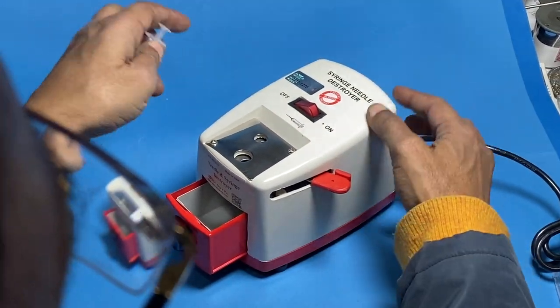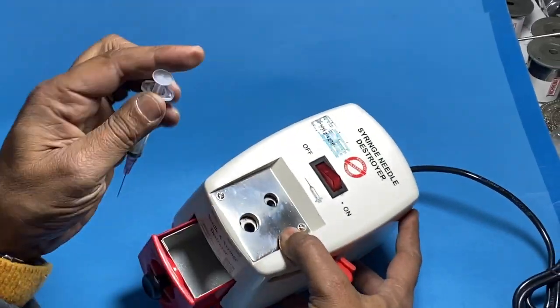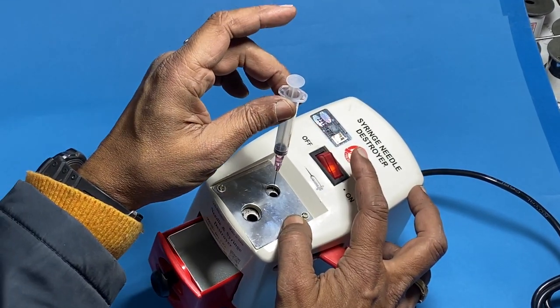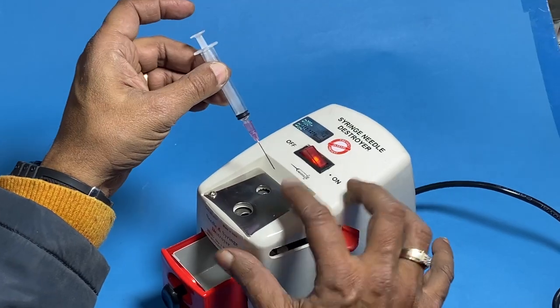This is a needle syringe needle destroyer by Abron. It has a cutter also in this section. First of all, we have a switch — turn it on, then push it, and it starts. Initially it will burn and then this needle will be burned.